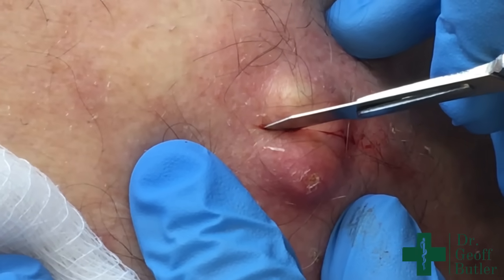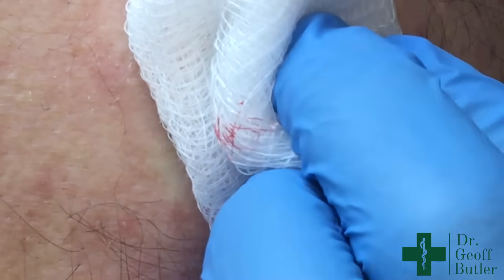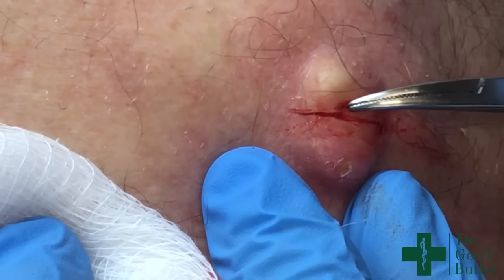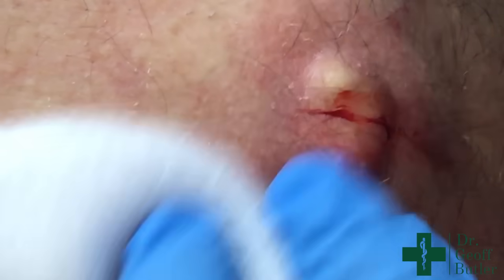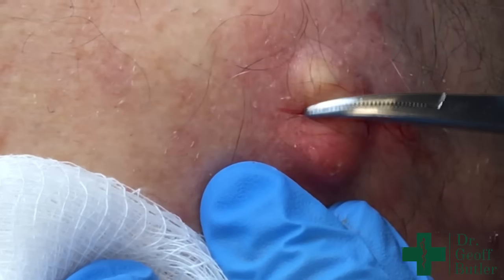This is a lesion that's thought to develop from trauma — trauma driving the epidermal cells down into the dermis. When I get to the right level, what you'll see is that when it doesn't open up, it's being resisted by the dermis, which is still attached.